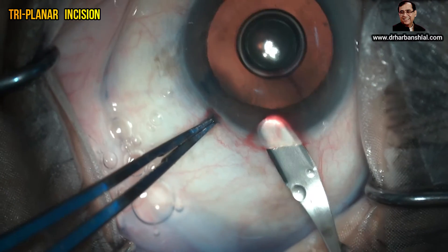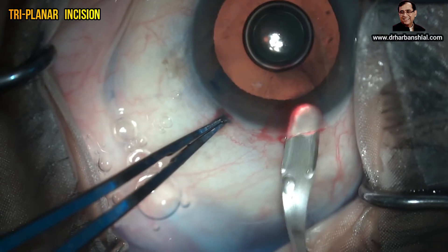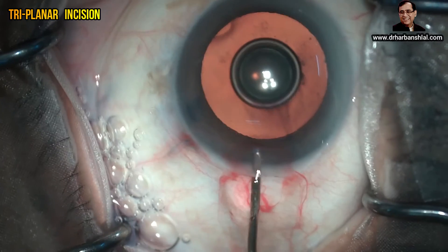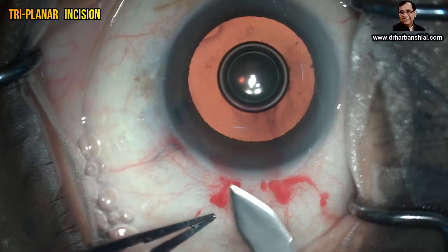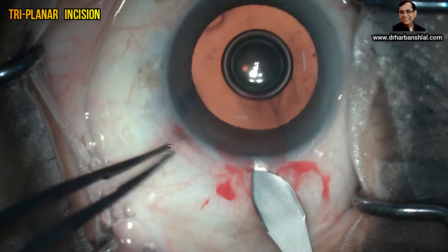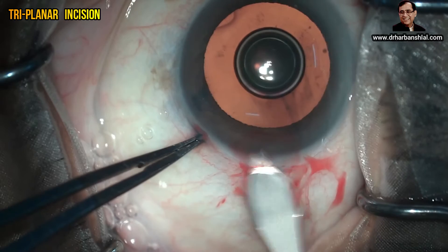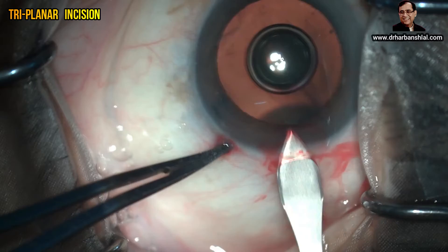Once the wide pocket has been achieved, keep going toward the central part up to 1.5 to 2 millimeters deep. Now inject viscoelastic to delineate the inner lip and also to facilitate putting the keratotome. With a side-to-side movement, put the keratotome in and go up to the inner end of the pocket.